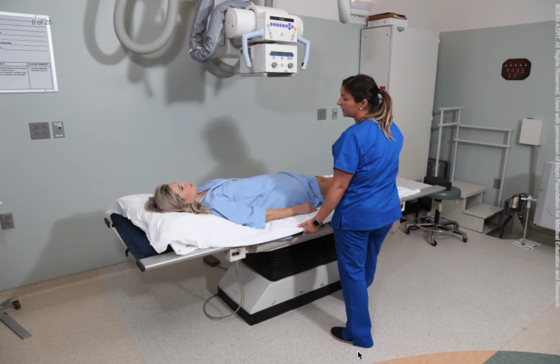Patients must remove all clothing in the area of interest. If needed, patients are provided with a gown for privacy and to prevent the patient from getting cold.